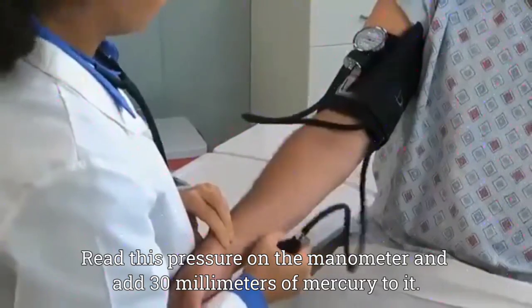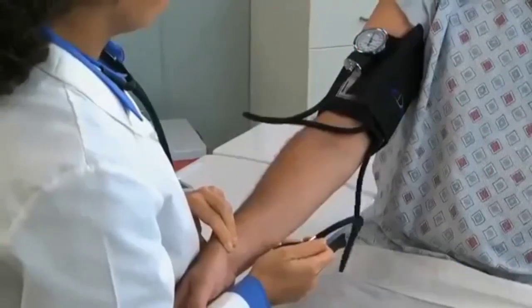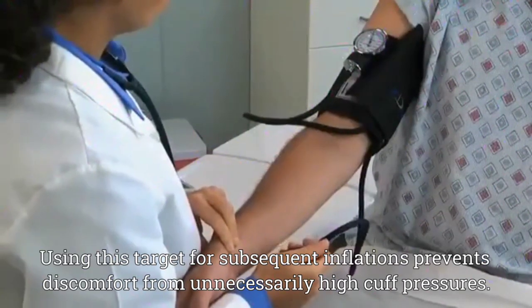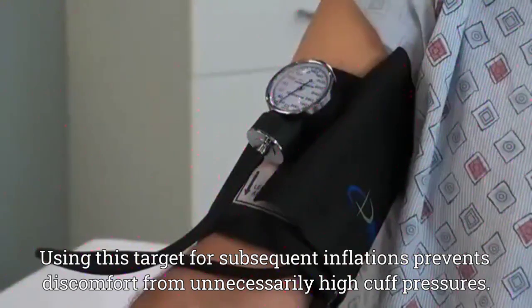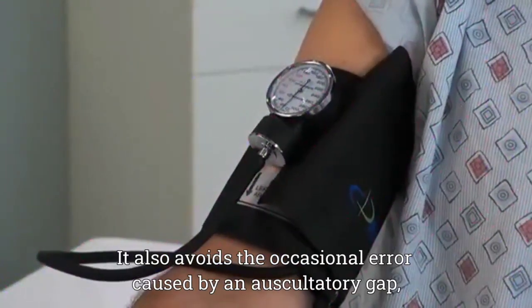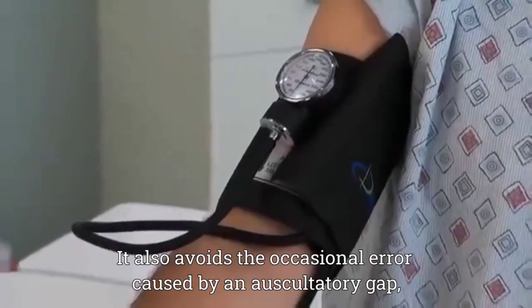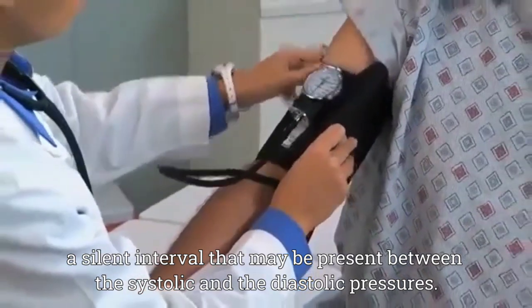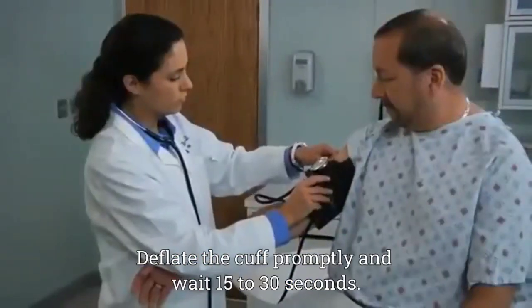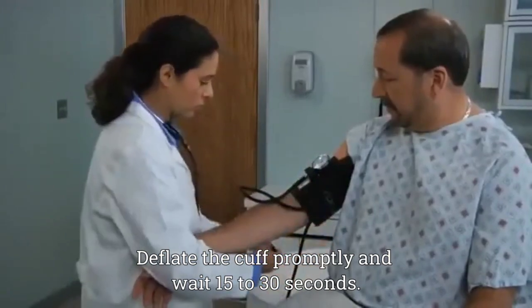Read this pressure on the manometer and add 30 millimeters of mercury to it. Using this target for subsequent inflations prevents discomfort from unnecessarily high cuff pressures. It also avoids the occasional error caused by an auscultatory gap, a silent interval that may be present between the systolic and the diastolic pressures. Deflate the cuff promptly and wait 15 to 30 seconds.